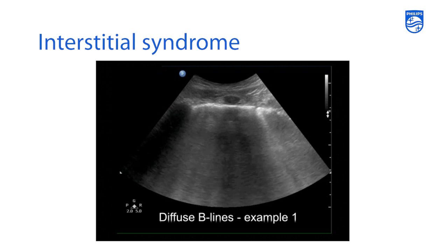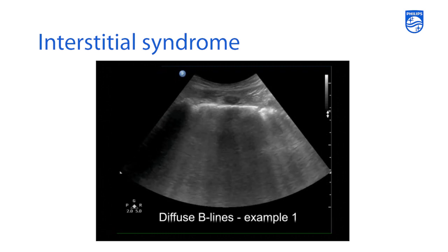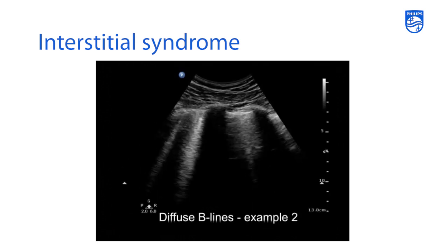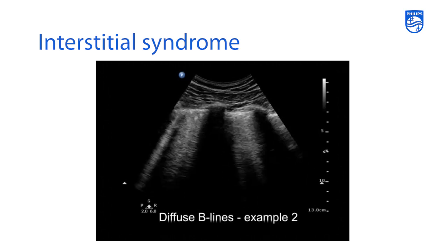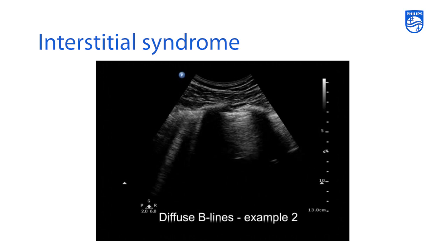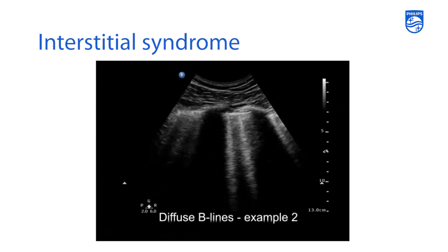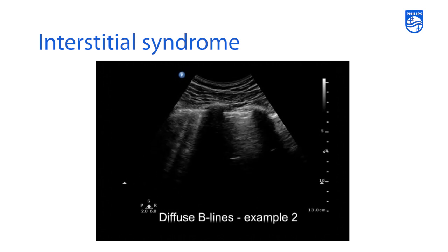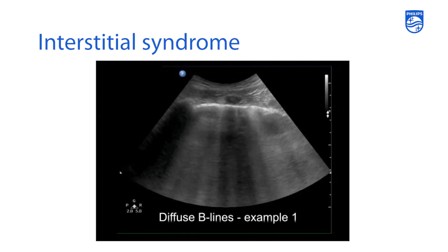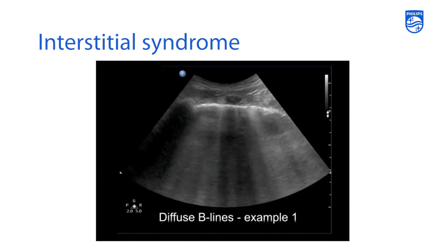This is an example of what B-lines look like in a patient with pulmonary edema. They're diffuse. They're usually bilateral. Across the entire field, there's no real sparing of areas within the lung where you're seeing B-lines versus not seeing B-lines.